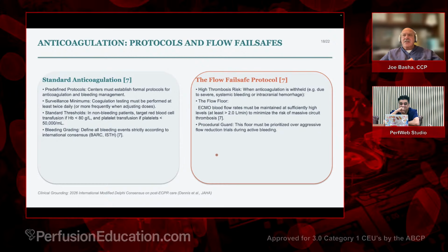And it just really was challenging. This was a more complex cannulation, and a lot of flow going a lot of different places, and ultimately we had to go up on the anticoagulation because this was going to continue to be a problem. You really want to avoid getting thrombus in your circuit, but in this particular case we definitely had it on 2 occasions, and then we made a change, but we probably should have done that after the first one.